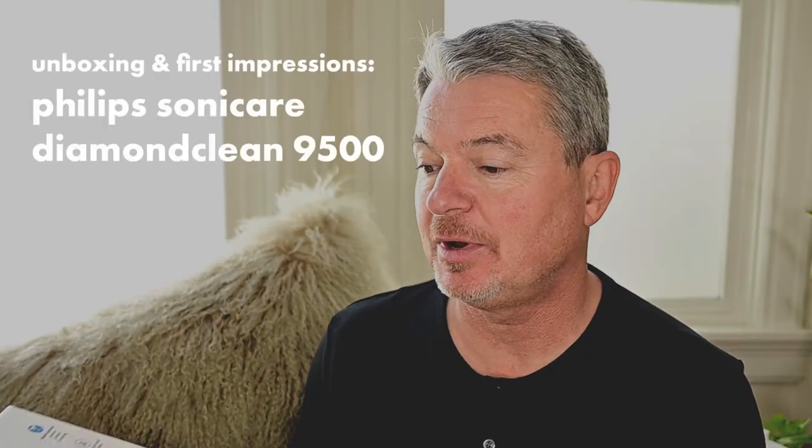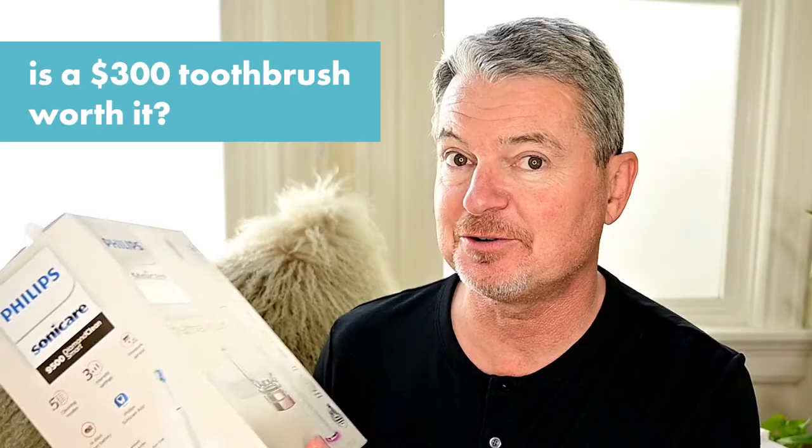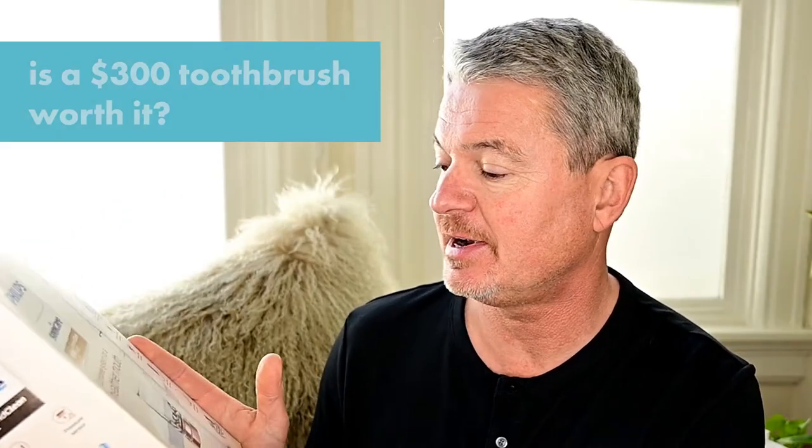Hi, Dr. Mark Burhena here of AskTheDentist.com. So today I wanted just to unbox this. I ordered this, paid for it with my own money — $300 for a toothbrush. This is the middle of the line. And there are two features here that I'm very curious about. So let's see what this baby can do.